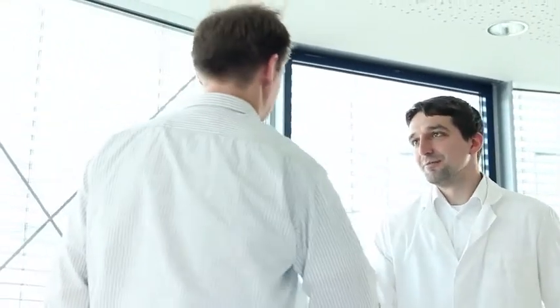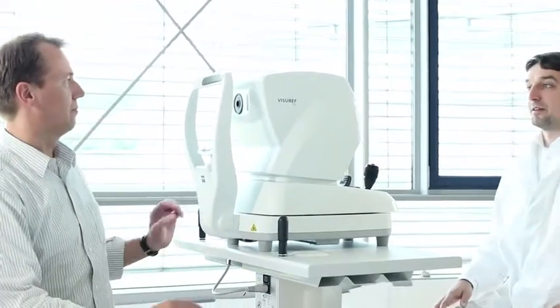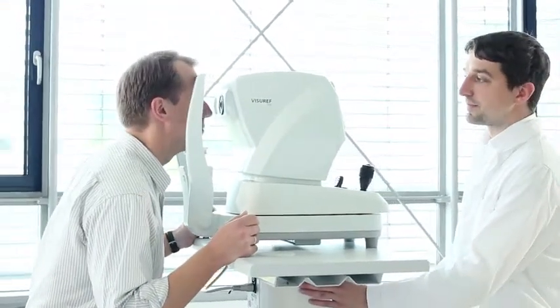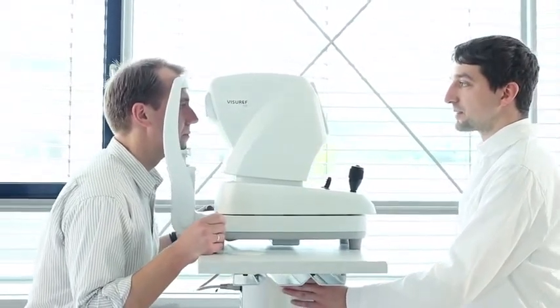If you need to perform objective refraction every day, you will appreciate the simplicity of the Zeiss Viseref 100. Simply seat the patient in front of the device and use the motorized chin rest and instrument table to position the patient comfortably.